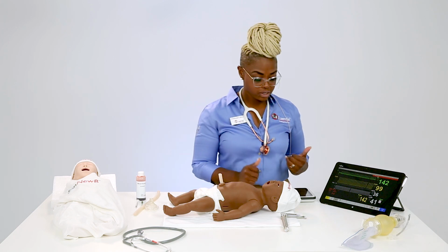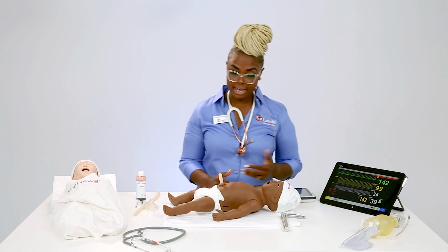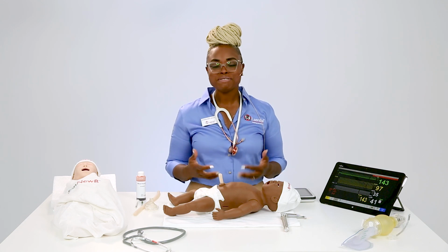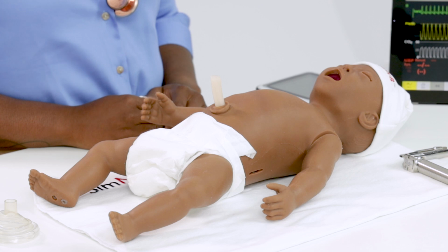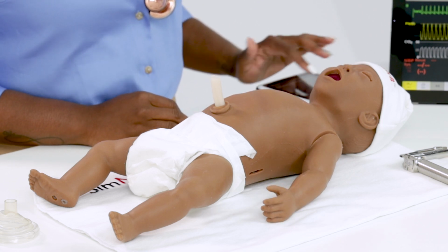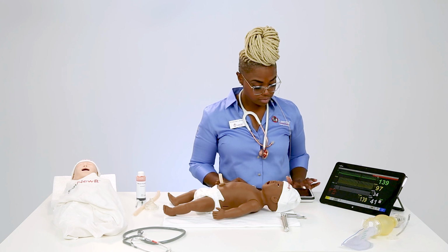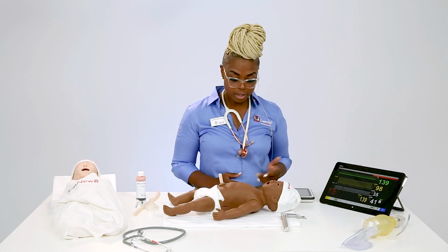Last of SimNewB's features that I would like to discuss are his sounds. SimNewB has a library of sounds, and we're going to go over some of those. With the vocal sounds, of course, he's a baby, so he's not going to be talking. But what do babies like to do? They love to cry. SimNewB is able to cry, and you're able to program that into your Simpad.